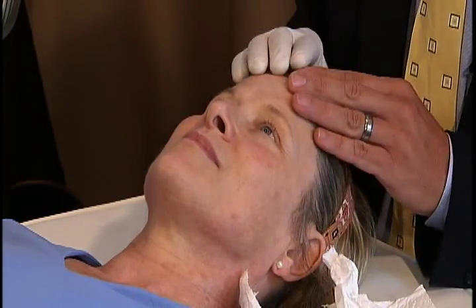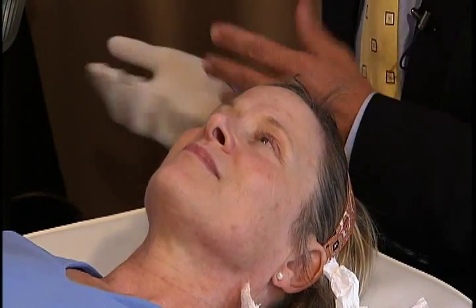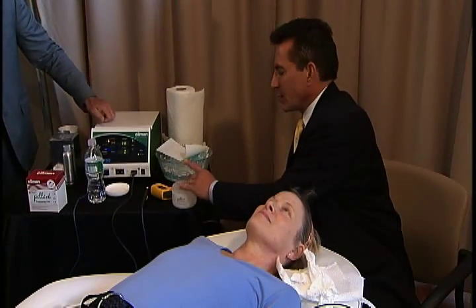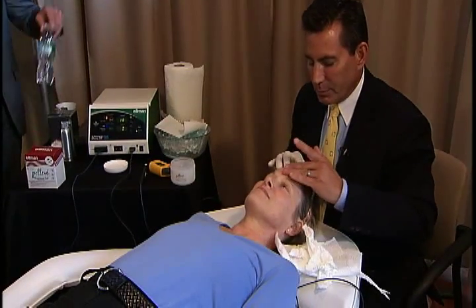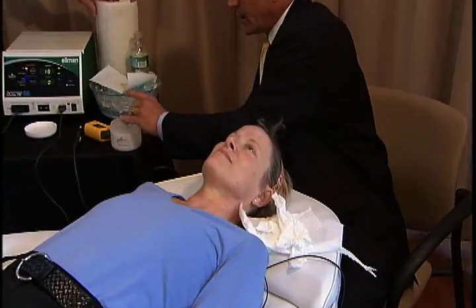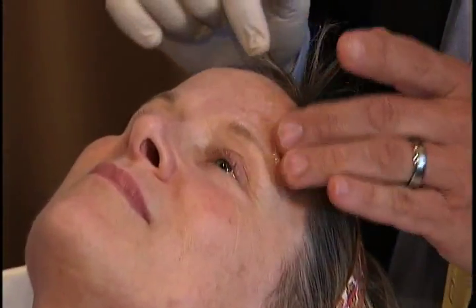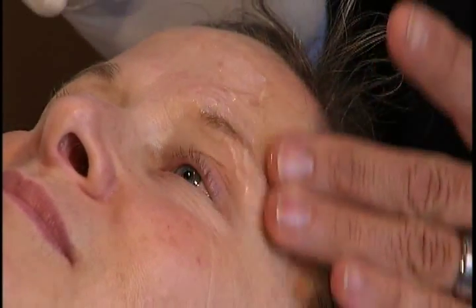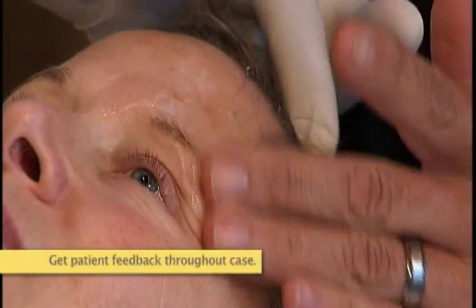We can start on her forehead, I guess. There is no rhyme or reason to start low or start high. So I'll go to 18. She's got relatively thin skin, a prominent bony boss of her forehead. Now this goes from warm to warmer, okay? And what we don't want it to do is to get too hot where you want to pull away. So if I'm not moving just in the nick of time, just raise a finger or just say, that's getting hot.